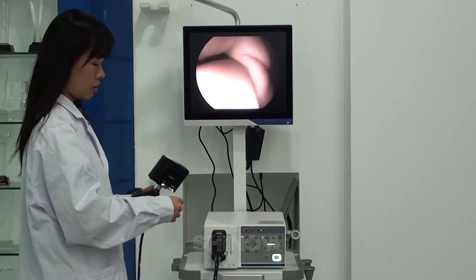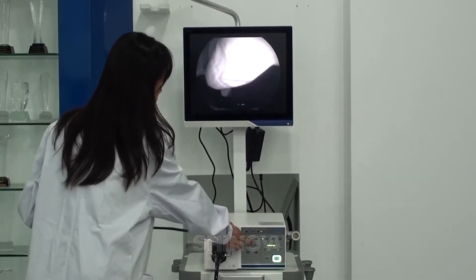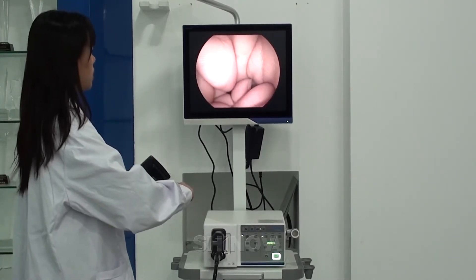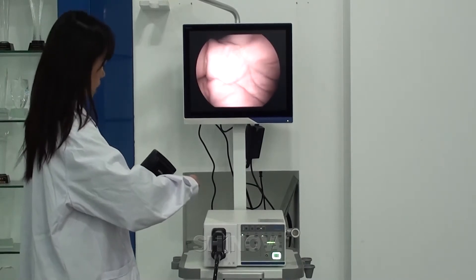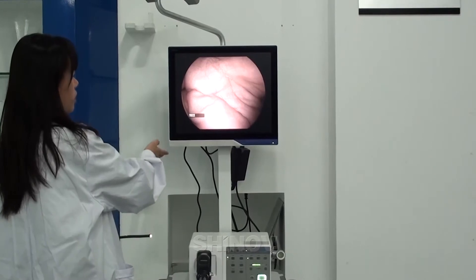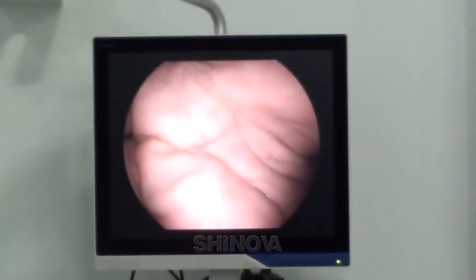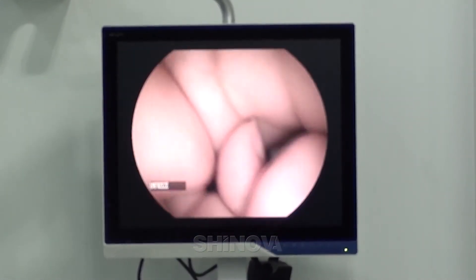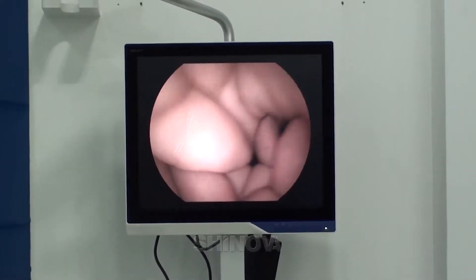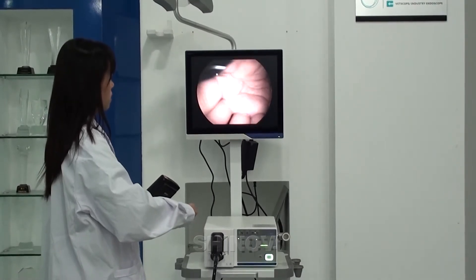Now I want to introduce the resolution of our Innoscope to you. The IRIS is in peak mode, and the enhancement and AGC are at the third level. You can see the resolution from the monitor — it's very clear. You can press the freeze button from the control body and see the picture detail. The resolution is very high and very clear, and the color is very real.